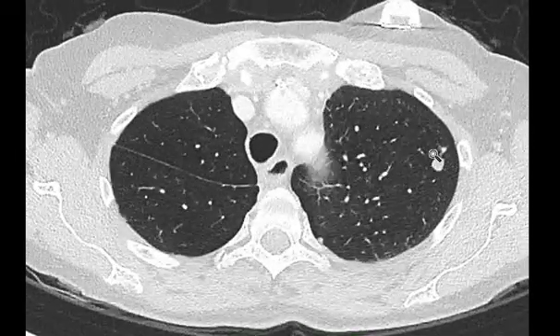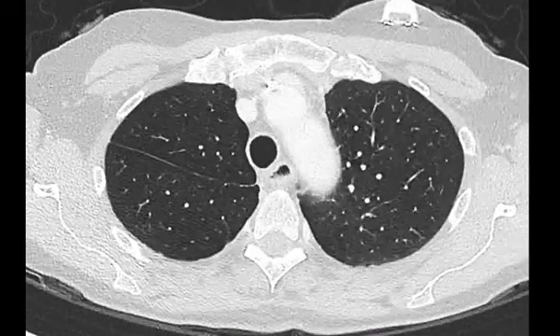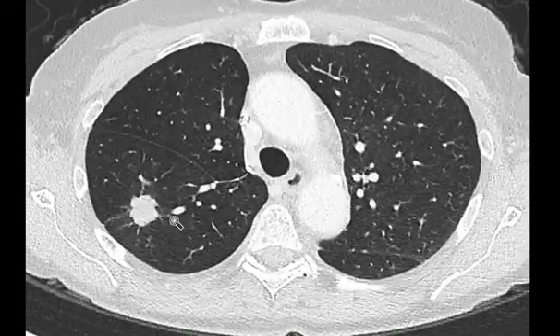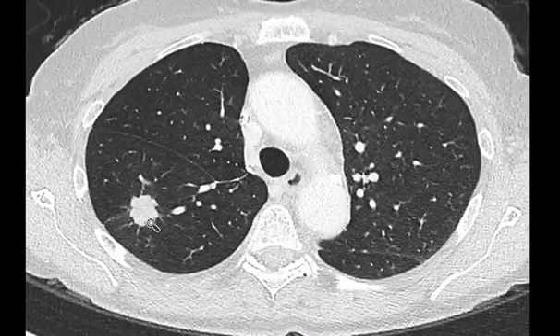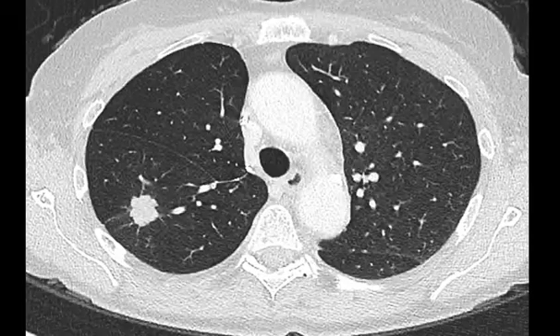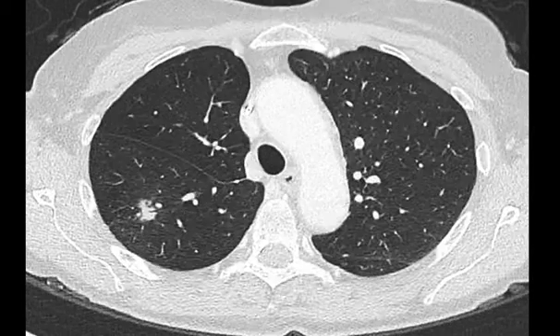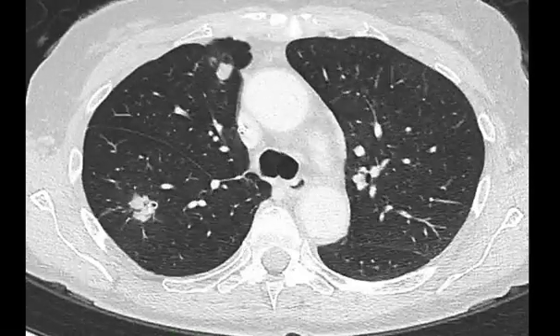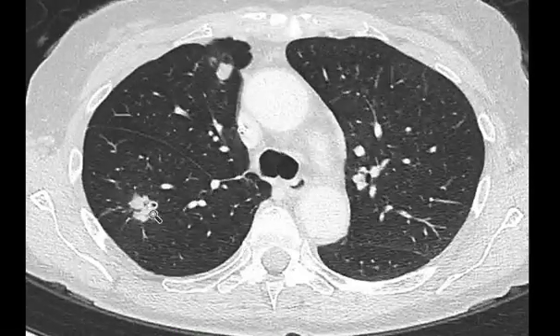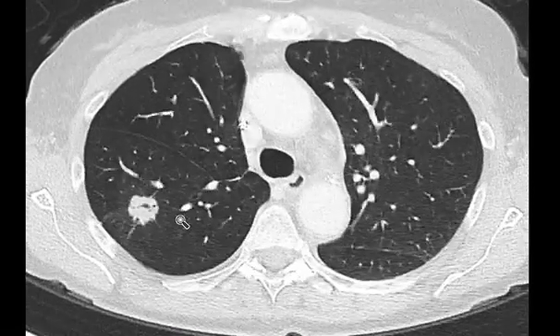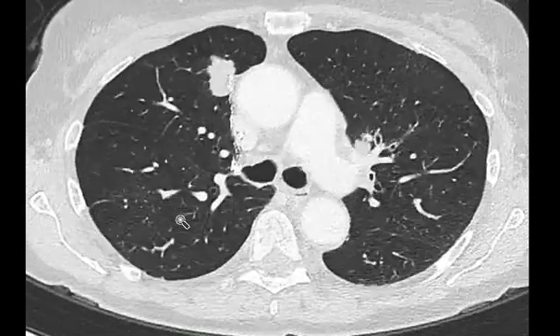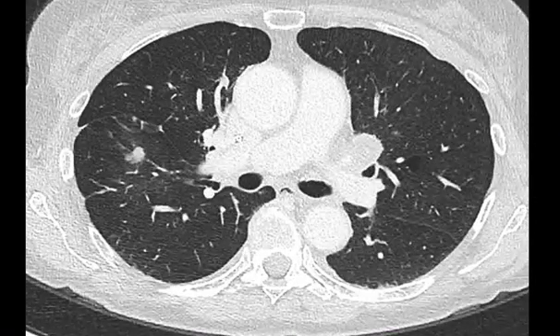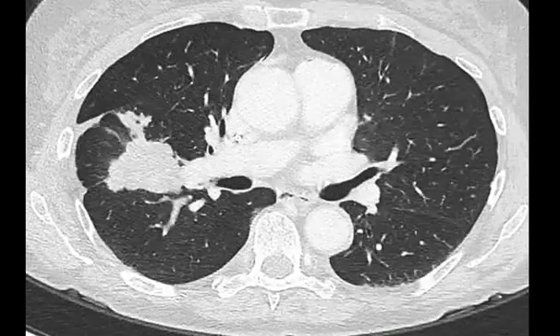There's a nodule here in the left upper lobe — looks like a metastasis — which would be difficult to access. Here's a nodule in the right lower lobe apical segment. Just here is an airway leading to that lesion, which would suggest that this lesion would be amenable to biopsy bronchoscopically, but would require radial EBUS.